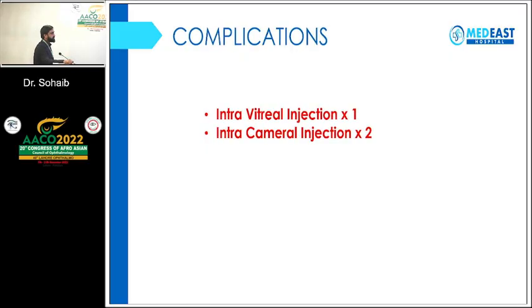The complications I encountered were with intravitreal injection in one patient, and in two patients, the drug somehow did not go into the vitreous, but actually came into the anterior chamber. I discussed it with my mentor, Professor Khurram Mirza, a well-known VR surgeon, and we were of the view that, since both were young patients, the anterior hyaloid face was preserved, and the crystals just swooped into the anterior chamber between the lens and the iris, just a few crystals.